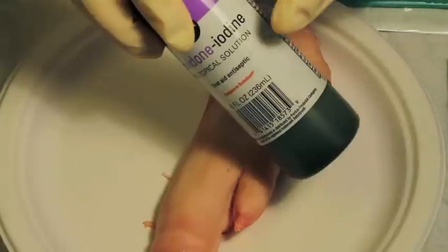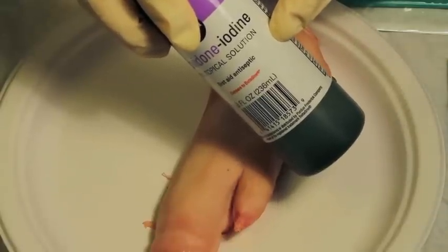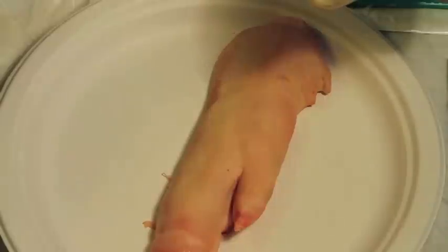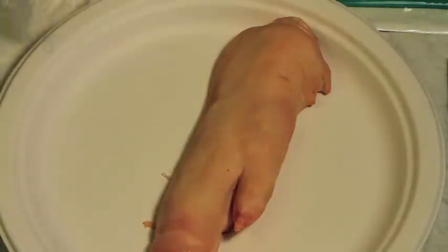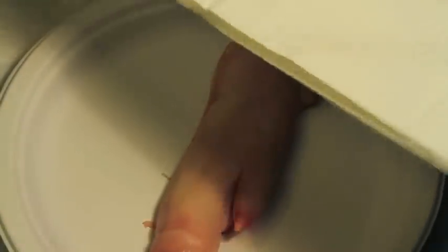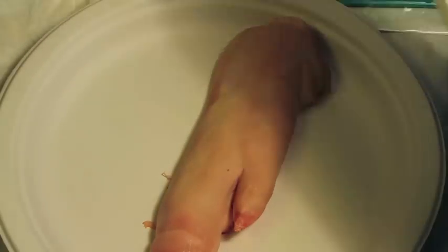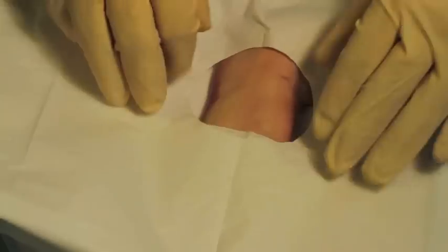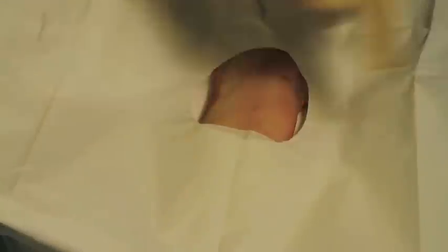First you're going to start by cleaning the area. We're going to use something like povidone iodine solution, or betadine, and cover the area that is going to be sutured. You want to drape the area, so you're basically working with what we call a sterile field. Here you have the drapes being placed over the area where we're going to make an incision that we're going to suture together.